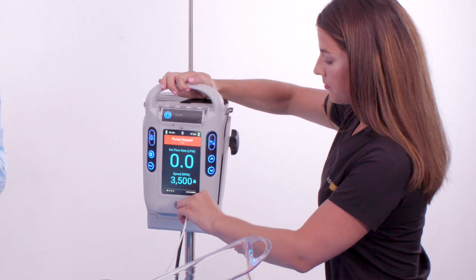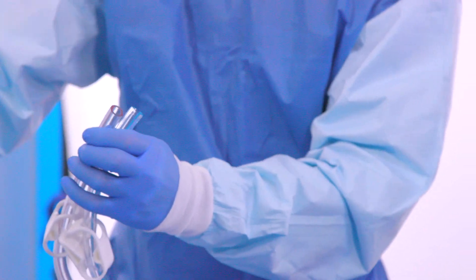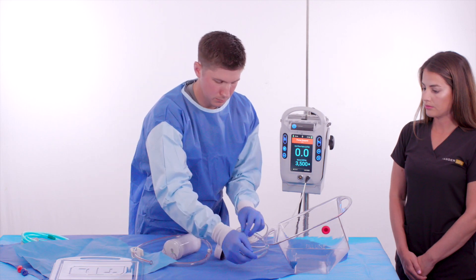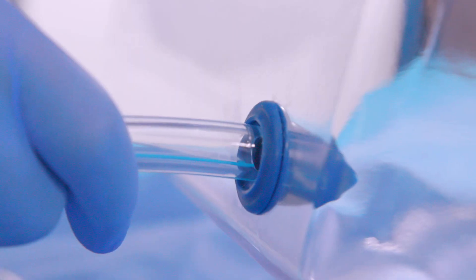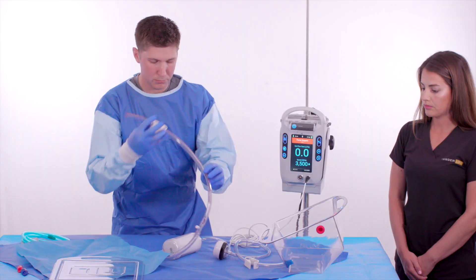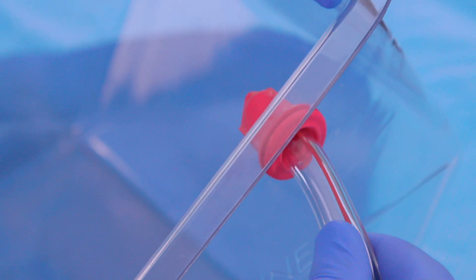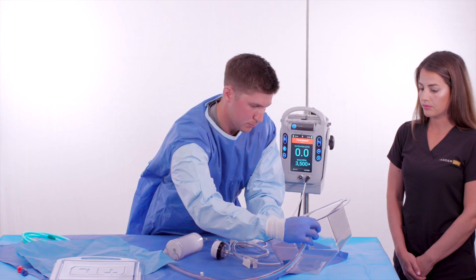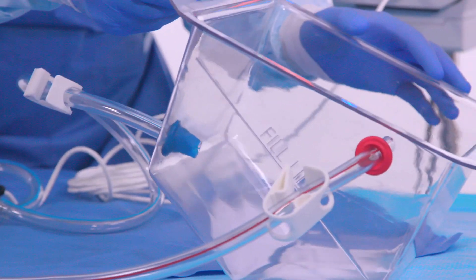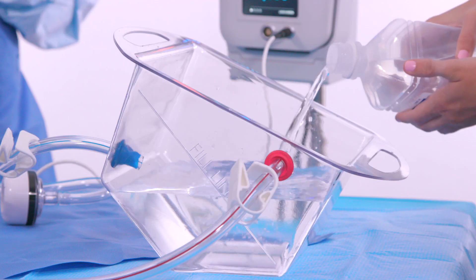The sterile operator removes the red and blue protective tubing caps from the pump tubing, then plugs the pump inflow tubing into the basin's blue port — blue stripe to blue port — and the pump outflow tubing into the basin's red port — red stripe to red port. The sterile operator ensures the tubing is passed through the ports into the basin, and that the basin is in the fill-ready position, tilted back and away from the blue port.